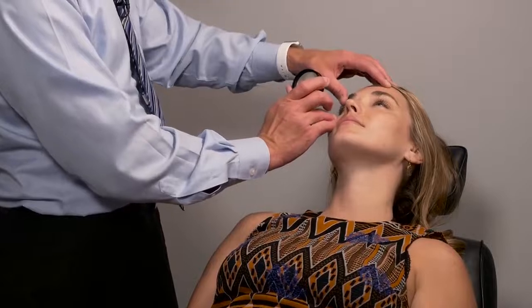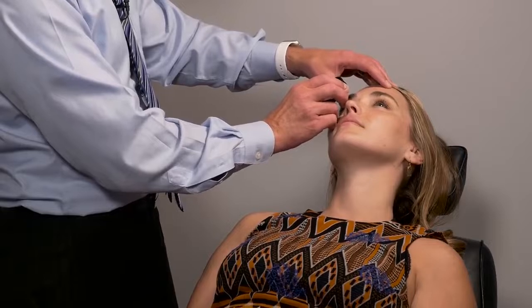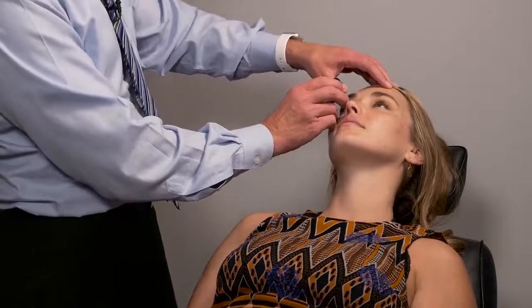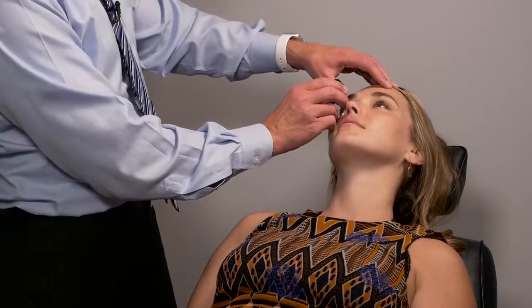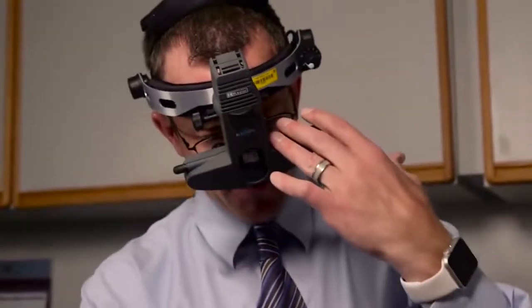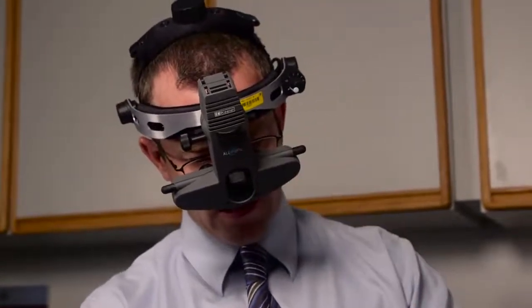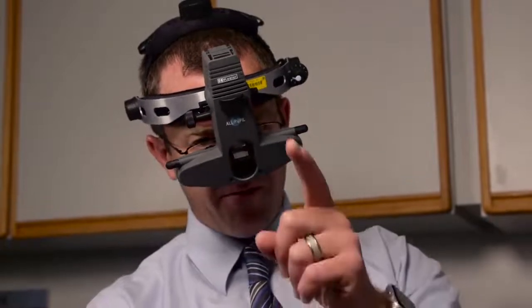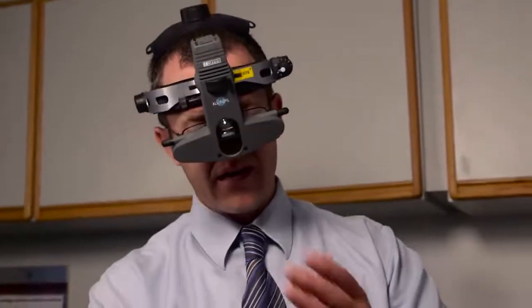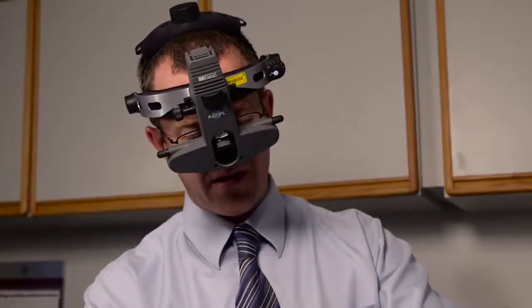The key in getting the retina in view is you're going to put the lens in front of their eye. You'll be able to see in pretty good clarity their cornea and iris, and you'll see an orange-red reflex. When you see that, also notice how my head is positioned. Depending on where your head is, and you'll learn to adjust this back and forth in relationship to the lens, there'll be a distance that is perfect for you, depending on your size, your arm length, and the curvature of your hand, where every single time you'll get that retina in focus.